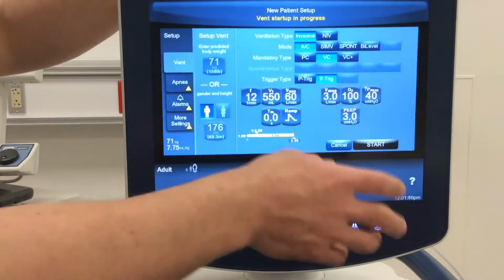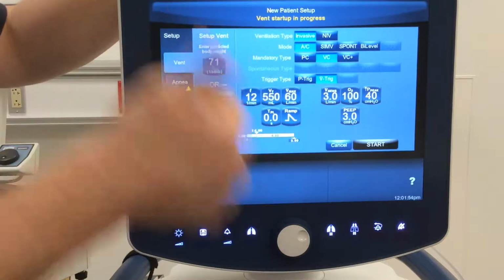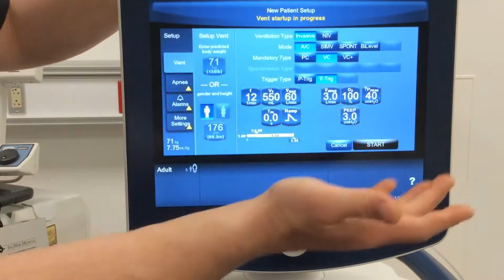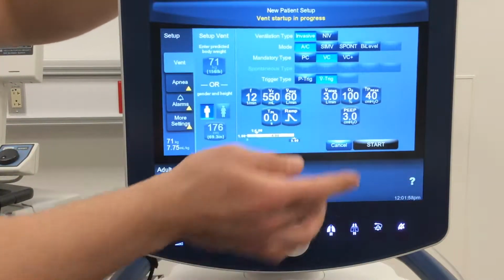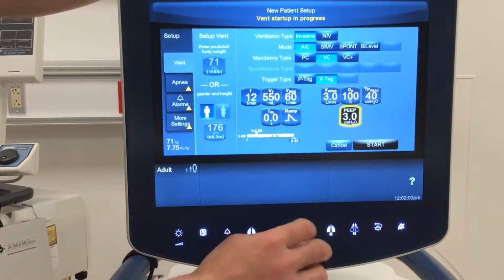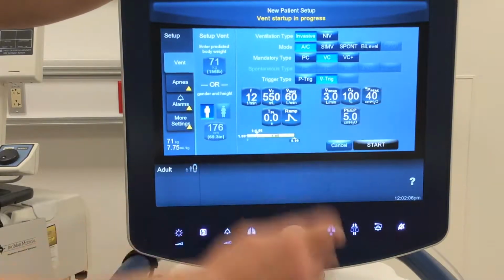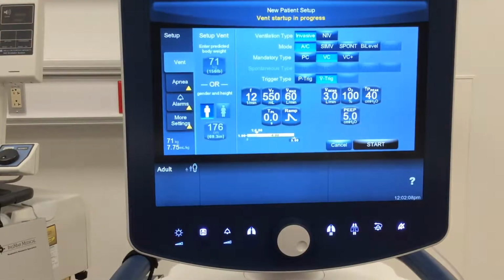This is going to be where you change your things that affect oxygenation, and when you think about oxygenation, that's going to be our baseline pressure. So we learned a lot about baseline pressure in the non-invasive segments. Remember, instead of calling it EPAP or CPAP, on invasive ventilation we're calling it PEEP. Okay, so PEEP, positive end expiratory pressure, is what's responsible for keeping the lung opened up, and it's going to drive oxygenation. It's going to prevent atelectasis. It's going to give us a lot of beneficial aspects.